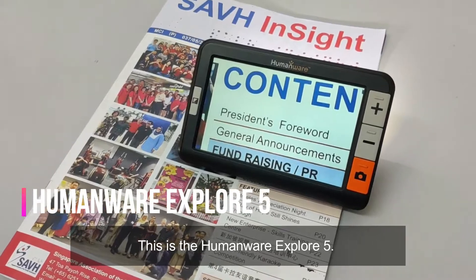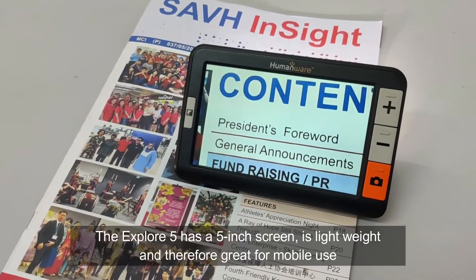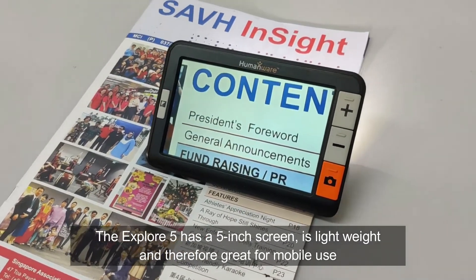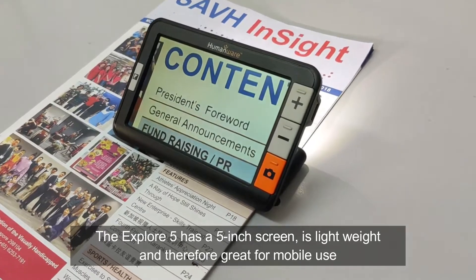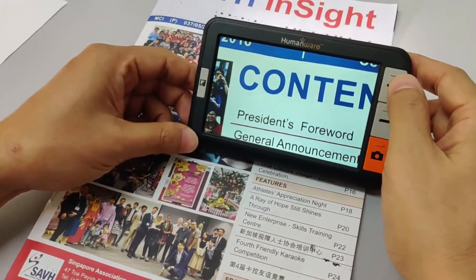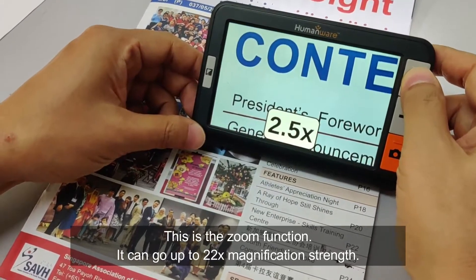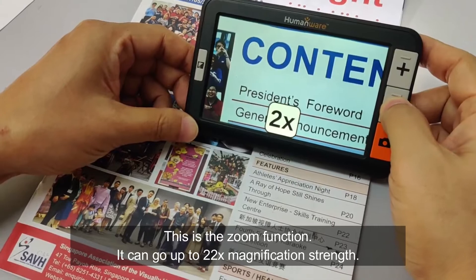This is the Humanware Explore 5. The Explore 5 has a 5-inch screen. It's lightweight and therefore great for mobile use. This is the zoom function — it can go up to 22 times magnification strength.